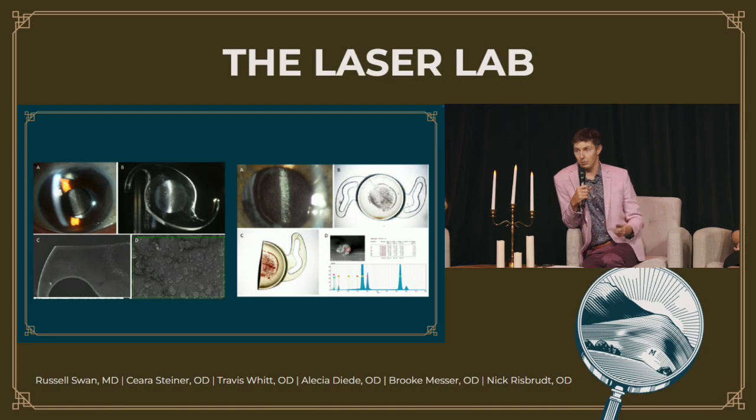The cornea cleared up beautifully, but their vision just never cleared up. And their lens, again, looks cloudy, and they were sent in for a YAG because they have a cloudy IOL. But when you're looking at it, it almost looks like the anterior surface of the IOL is cloudy. What say you? I'll pass this to Sierra.